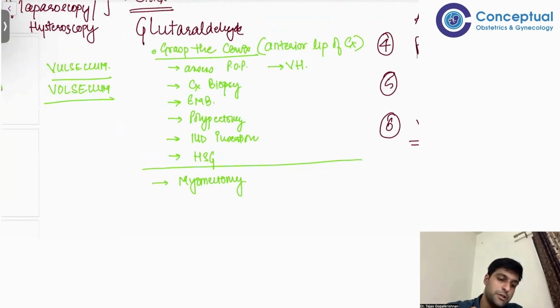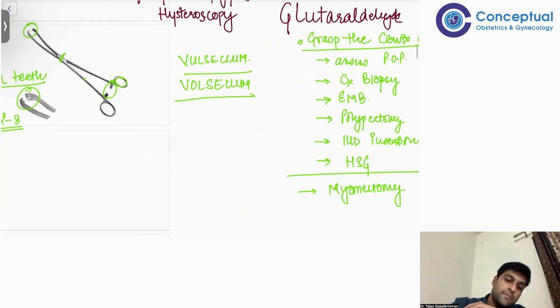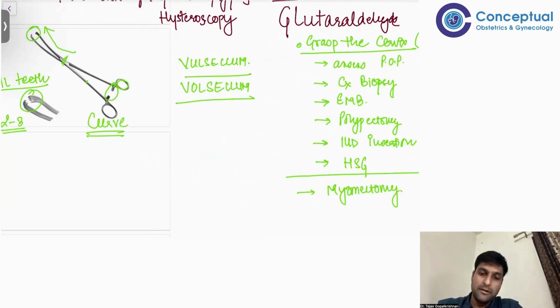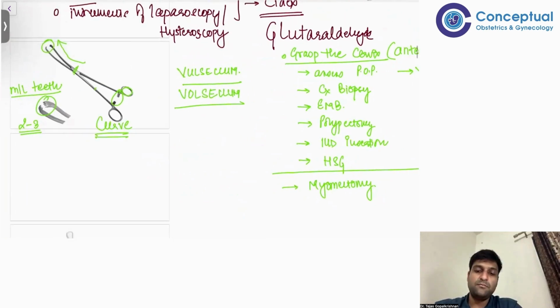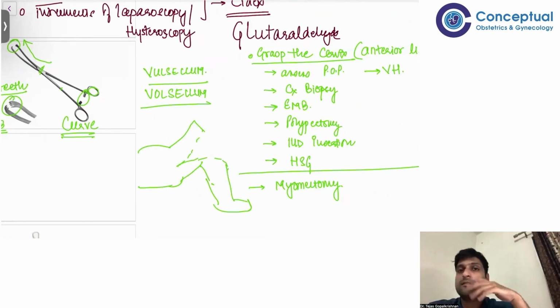How is the orientation of the Vulsellum, right? If you see, the Vulsellum has a slight curve. There is a curve to it. Okay. Do you know why this curve is there in a Vulsellum? Can you tell me why there is a curvature in the Vulsellum? Why is it a curved instrument?